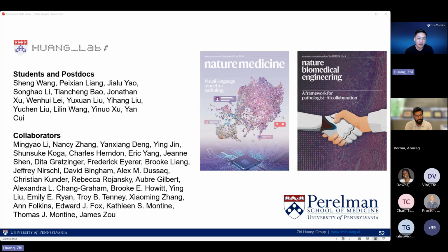And that's the reason why we believe that active learning could be the potential solution. Whenever you see the tool is imperfect, we want to make the model more interactive so you can fine tune it on the fly. And that's part of the reason why we rolled out this interactive foundation model for pathology segmentation, because we want the user to improve the tool on the fly to solve the actual problems.